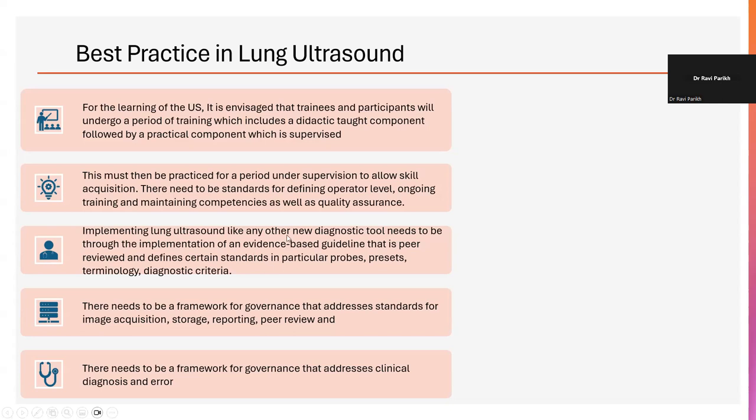And with that experience, and as we get more confident, we would be able to make a diagnosis of pathology. And if we're able to do that in a manner that's correct, then what we open ourselves up to is high quality scanning, in which the need for a governance framework is very important. And the reason for that is occasionally you will land up in the situation that I've just described. And we need to have a governance framework to address that.